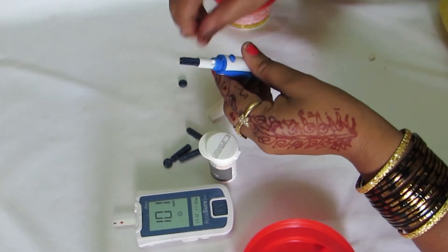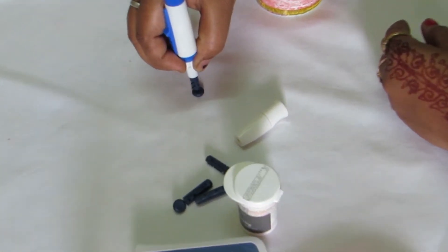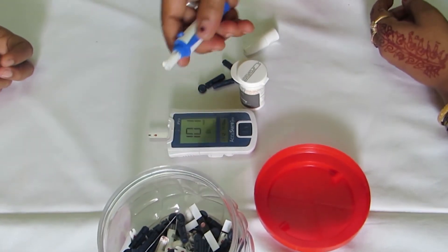Disposal of Lancet. As shown in the video, take off the cap of the Lancet and press it on the Lancet cap and eject it into the waste disposal box.